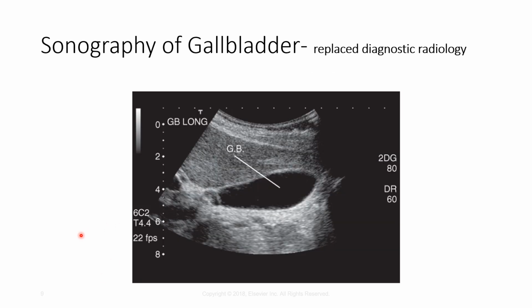This is a sonogram, which has significantly replaced imaging for the gallbladder. There's a few reasons why that is the case. There's four main reasons.